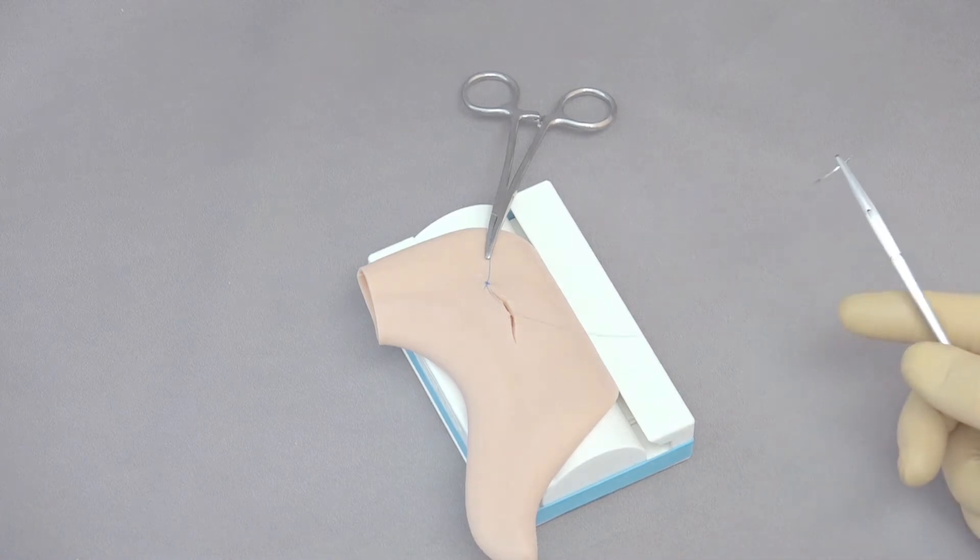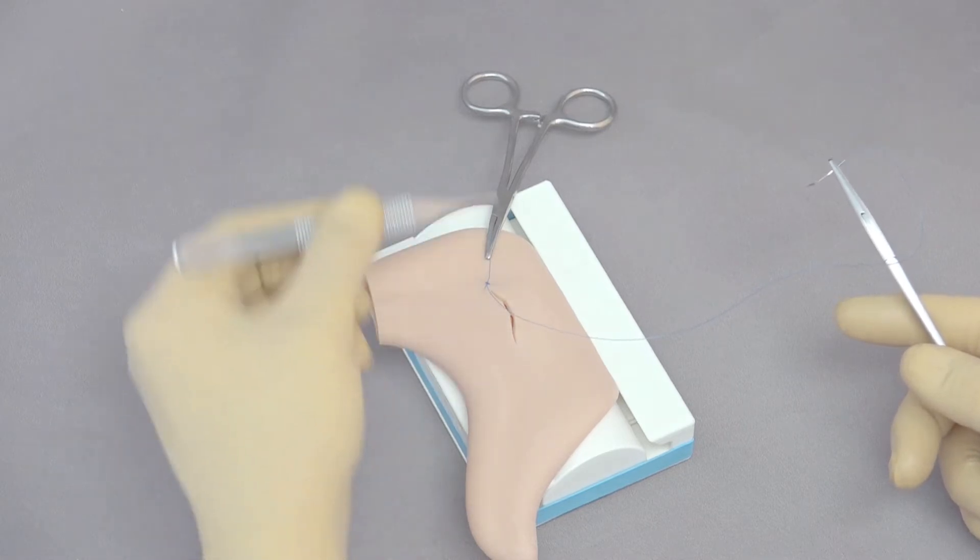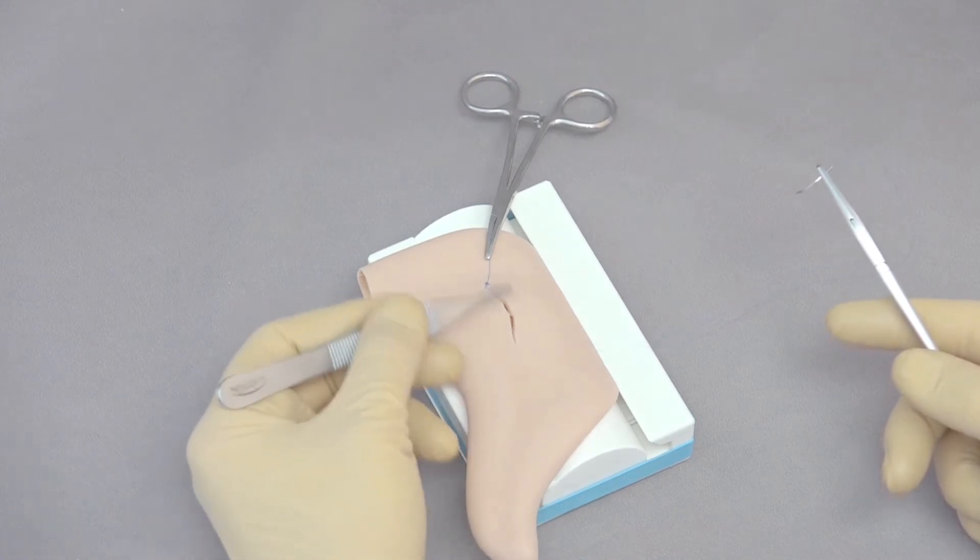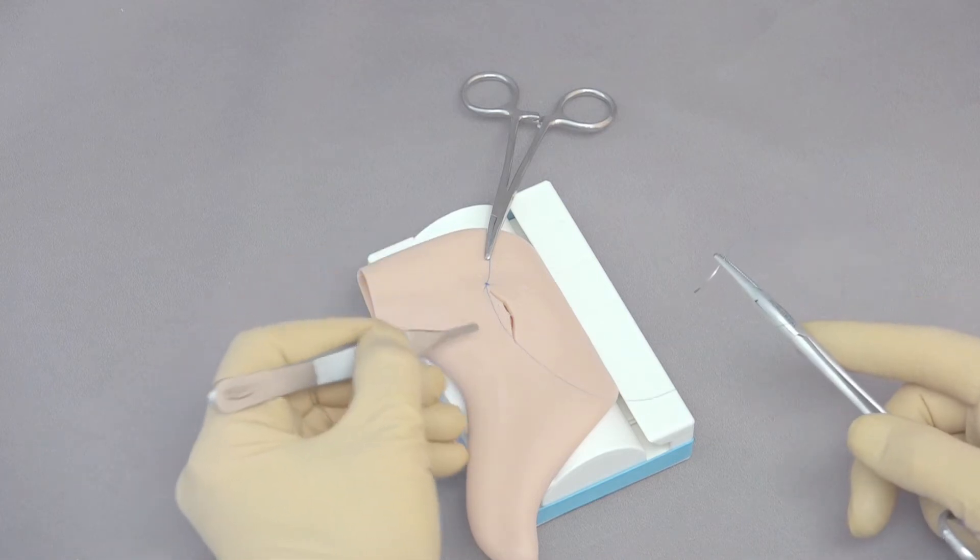Now we're going to continue this with a continuous pattern. I've started my pattern always when I'm doing a continuous at the far end of the incision, and work back towards my body, that gives me the finest motor movement, as well as the best ability to actually keep a nice, even suture line.